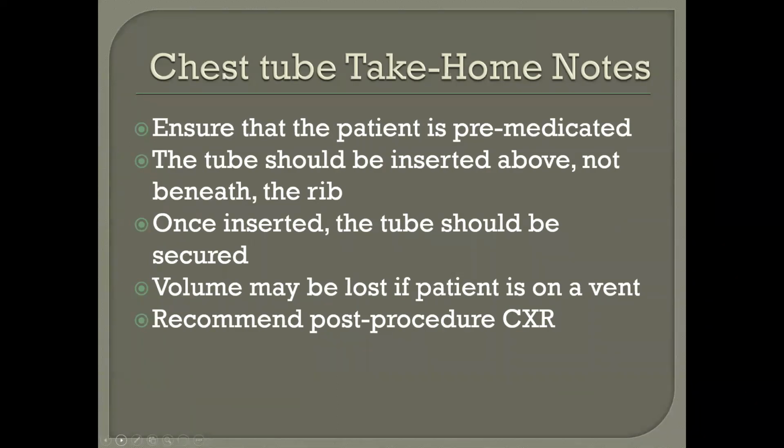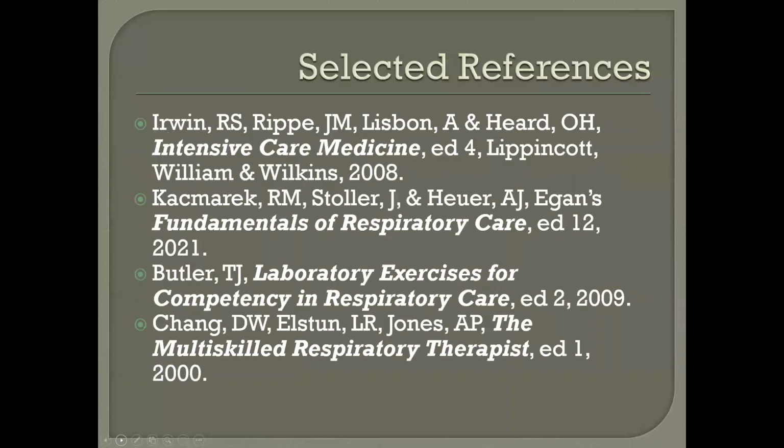If it's running to suction, which many times it is, you'll be giving the patient 500 mLs and getting 400 back, so you'd be losing 100, 125, whatever. Just keep that in mind as well. I recommend a post-procedure chest x-ray, like we did with several of our other procedures. Selected references: Irwin has a real good one. Again, I put a plug in here for Egan's Fundamentals, as well as some others.